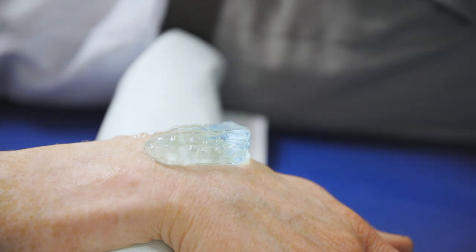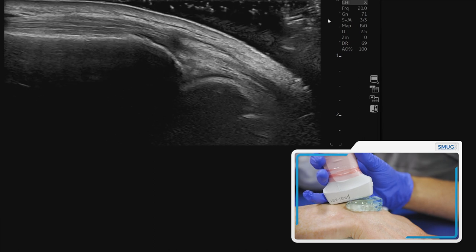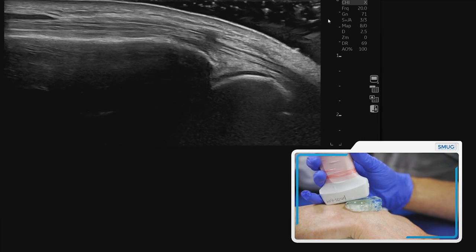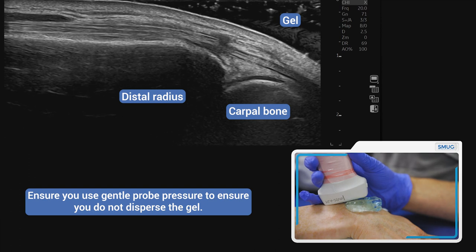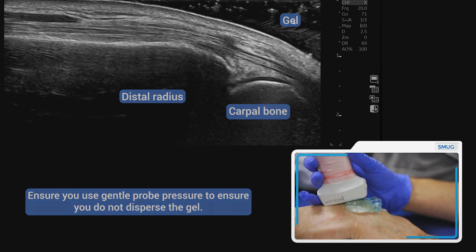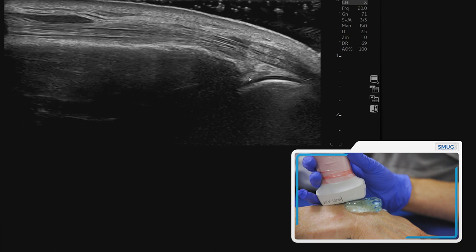What we've done here — and obviously you need to use sterile gel — is we've built up the gel on the probe, and this is called standoff. You can see the gel in the image, and this is why it's called standoff. This is the target here.